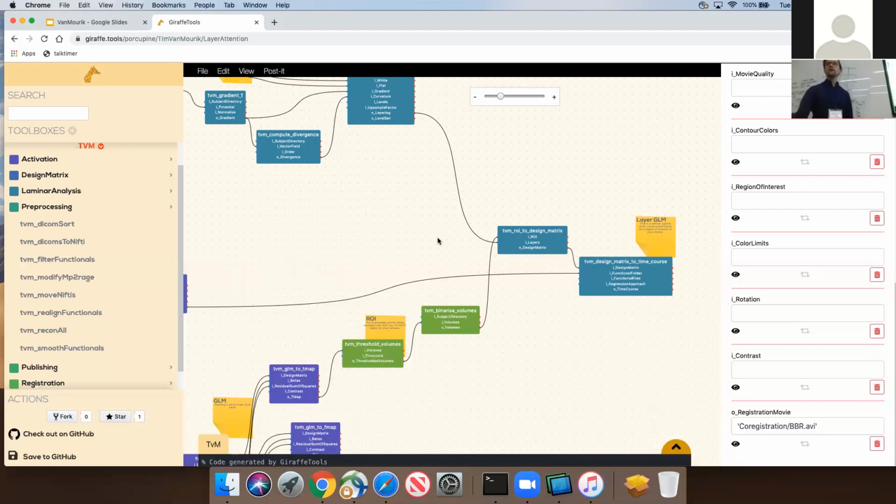Anyway, are there any more questions about this? Because one of the things I would really like to show is what your next analysis could be. Because we've always had a bit of a problem in the layer community. If you indeed have 100 interpolations, then it's very difficult to do adequate statistics on that, because every 1/100th of an element is very similar to the previous one.